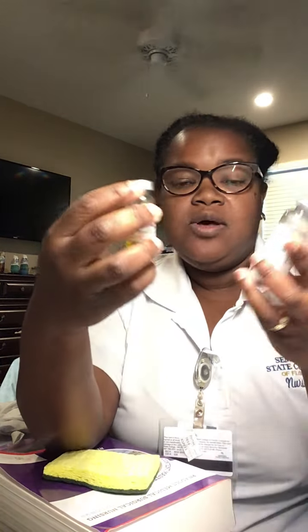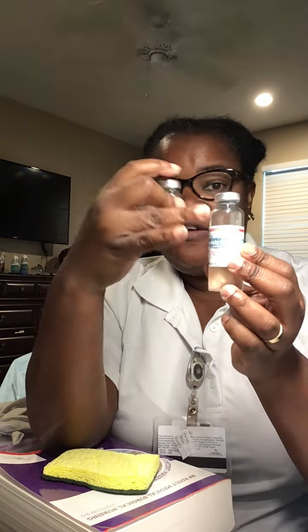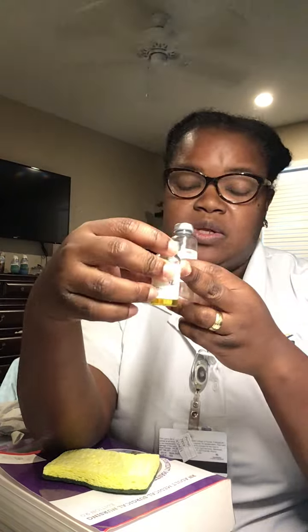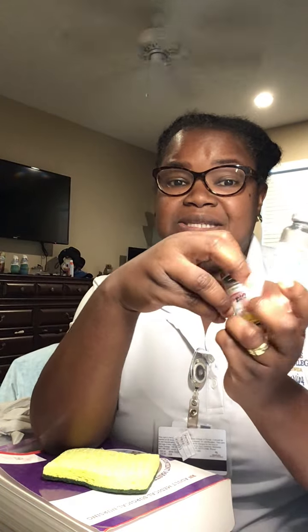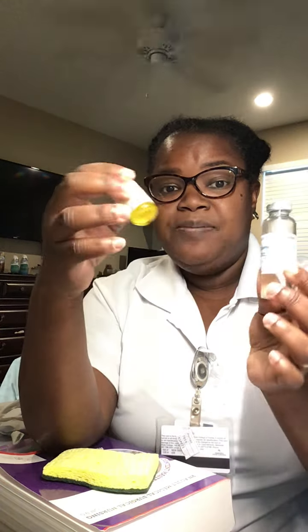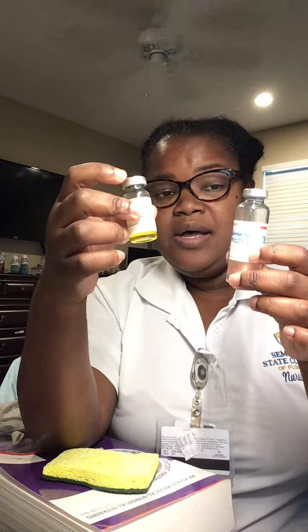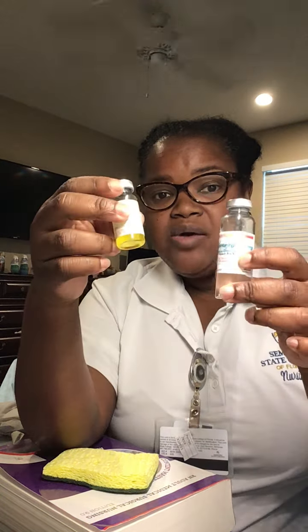For the vials, we need to first open each one: first open the influenza vaccine, then the B12. I have to put the day, the time, and my initials, because these are multiple use vials. Okay, let me just go ahead and start.